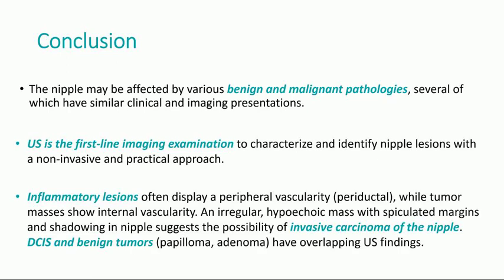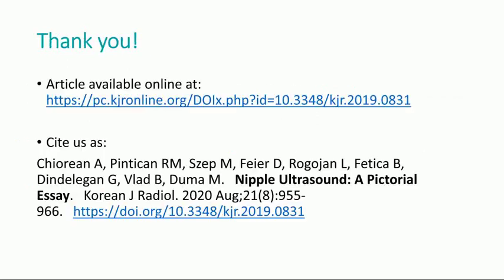Inflammatory lesions often display a peripheral vascularity, periductal or vessels in rim, while tumor masses show internal vascularity. An irregular hypoechoic mass with spiculated margins and shadowing suggests the possibility of invasive carcinoma of the nipple. Ductal carcinoma in situ and benign tumors may have overlapping ultrasound features. Thank you very much for your invitation.